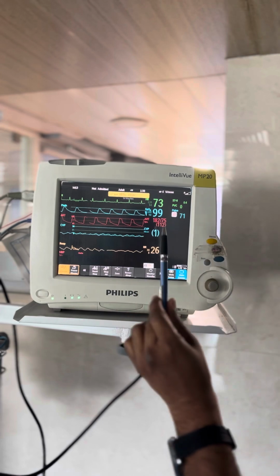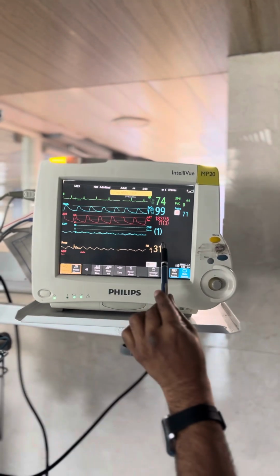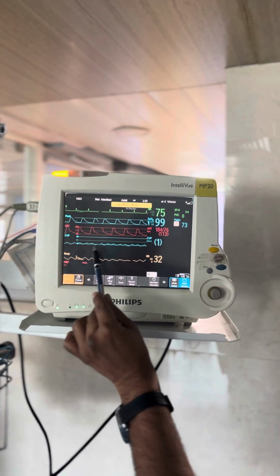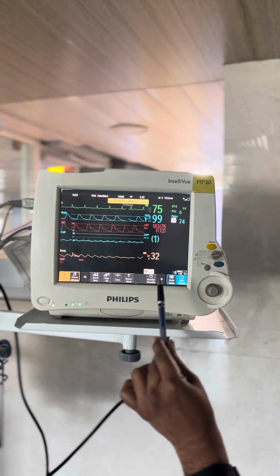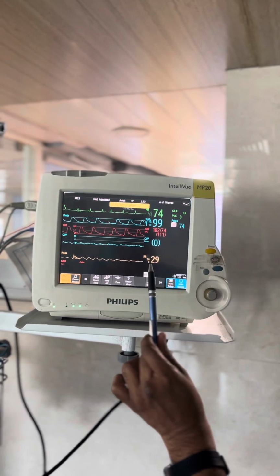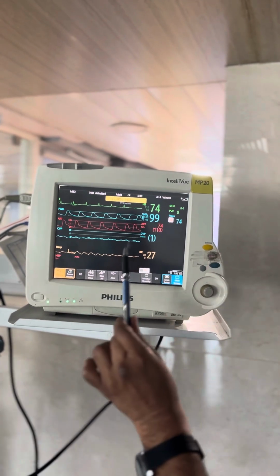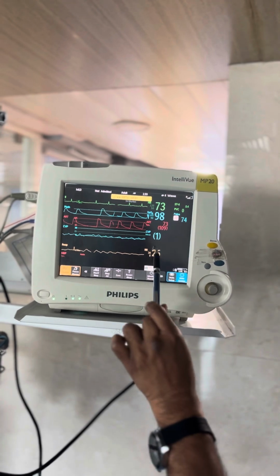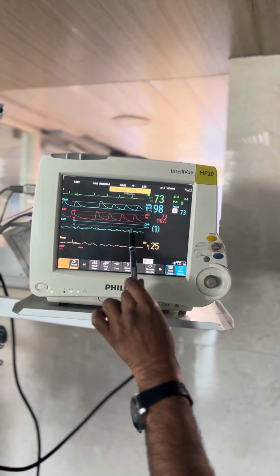That is the reason. Another unique feature of a post-cardiac surgery patient is the central venous pressure monitoring. The normal is 0 to 4. If it is high, there may be cardiac tamponade or cardiac failure. If it is low, the patient may be in volume deficit. These are the two important monitoring systems which we have.